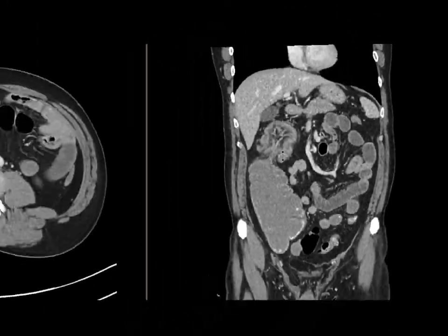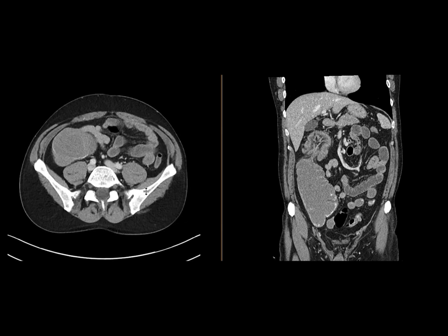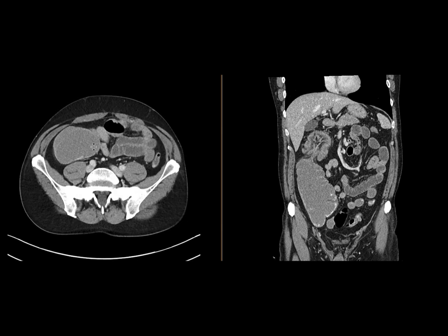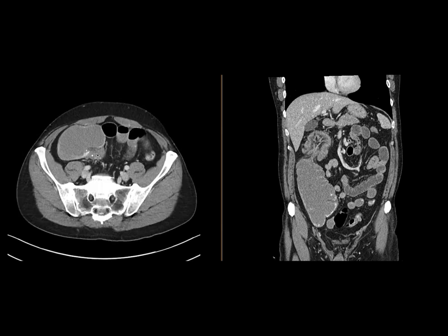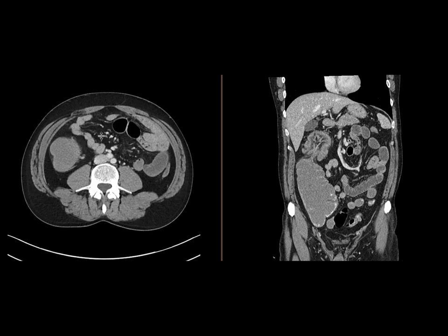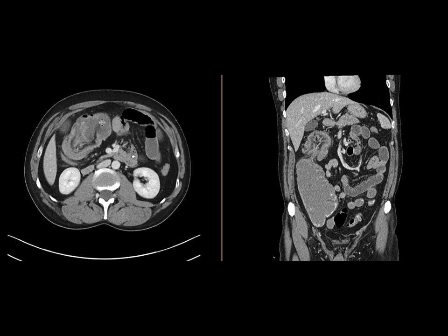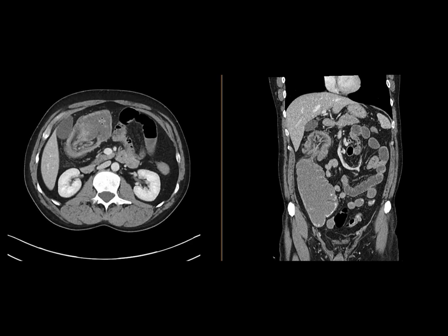Now, these can be associated with obstructions. You can see that the bowel upstream from this area of intussusception is mildly distended. With large bowel intussusceptions, you really have to be worried about a lead point.